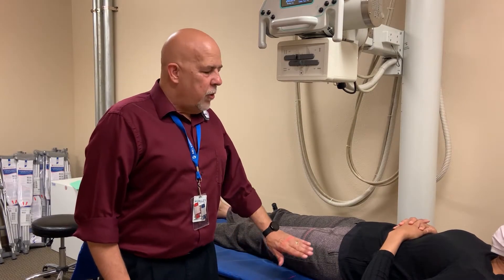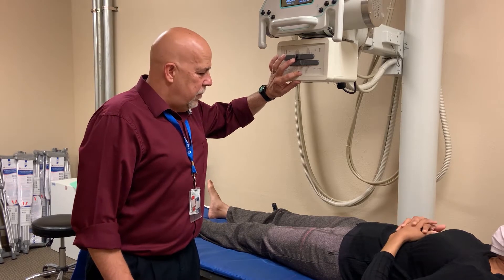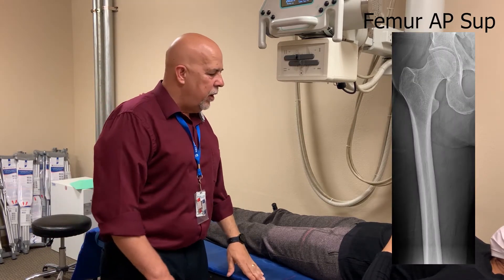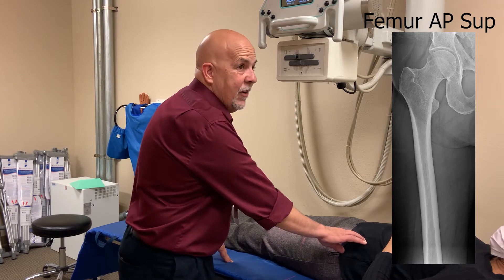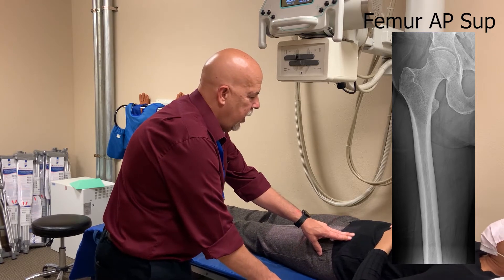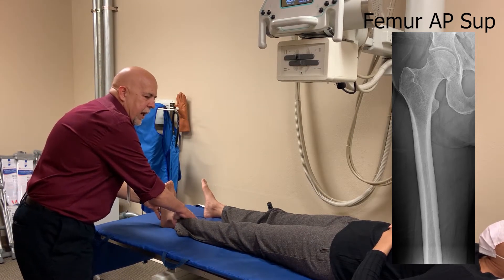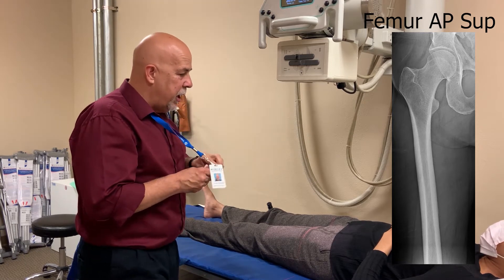Hello, Glenn again. We're going to do an AP and lateral femur, and our lovely Miss Nikki is going to help us out today. Nikki's pretty tall, so we cannot fit the femur on one image. On the first image, we're going to do an AP upper femur or proximal femur. You're going to push on the ASIS — the anterior superior iliac spine — that's where you want the top border of the film, so you're going to include the entire femur. Collimate down laterally to the mid shaft of the femur. You want to make sure that the toes are pointing straight up and the knee is in a true AP position, and you want to expose your first film after marking it properly.